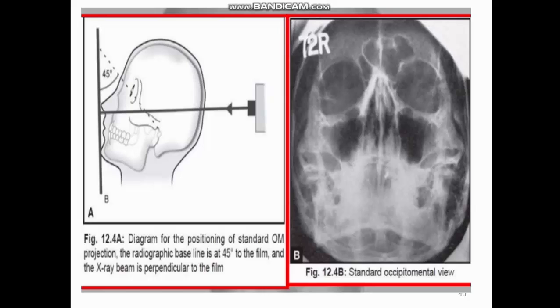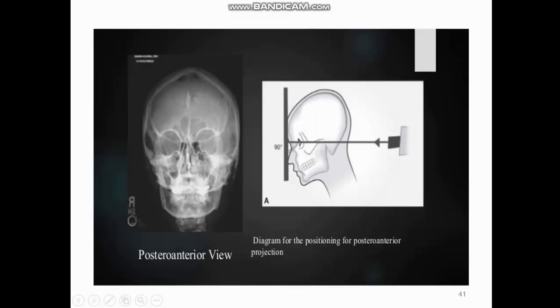Also, with the help of this method, we can investigate the frontal and ethmoidal sinus. Investigation of the sphenoidal sinus: the sphenoidal sinus, like a normal paranasal sinus, appears translucent, as you can see here. This is the maxillary sinus, frontal sinuses, and ethmoidal sinus.